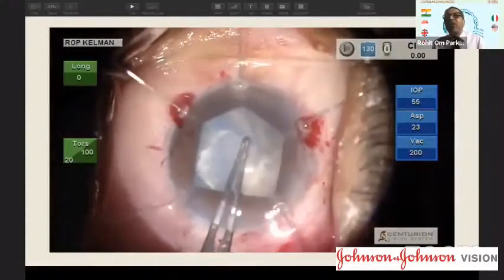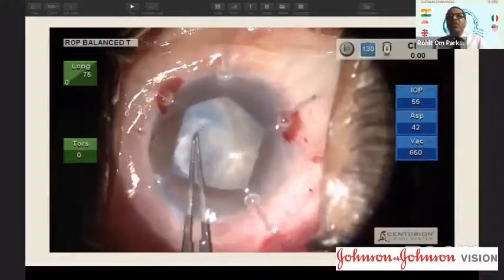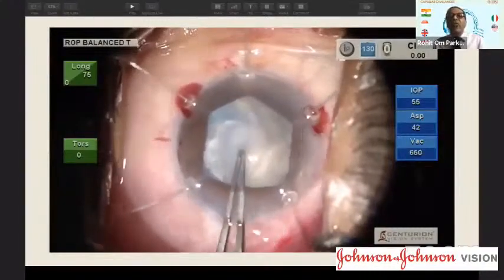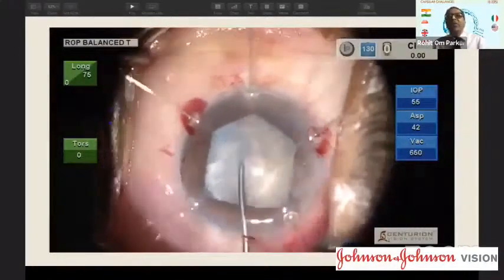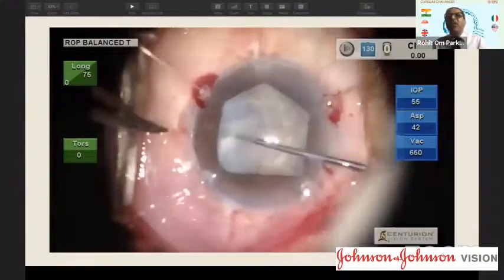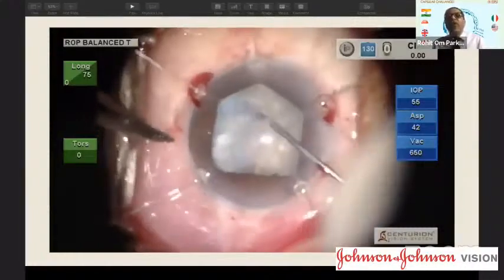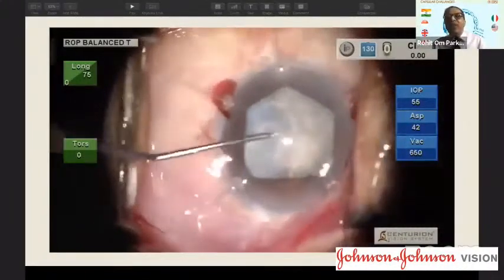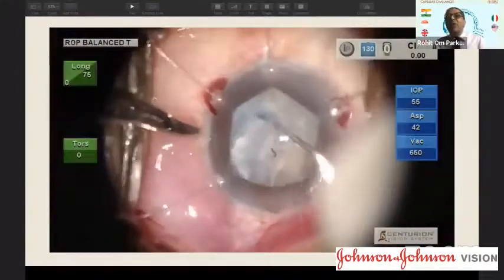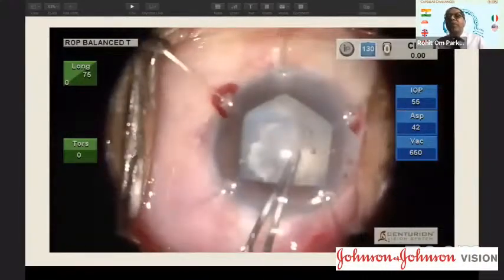So the scheme of things is that you complete the rexis central to the plaque, then comes the second part. Second part is you have to dissect, you have to separate the subcapsular plaque. So you'll see how the subcapsular plaque has to be separated. This is basically Deepak Magoor's idea, and he showed it in a beautiful video in ESCRS, which won the prize in our AIOS also. You have to totally dissect it from all sides. The plaque is not fully separated. So separate it and take out the subcapsular plaque.